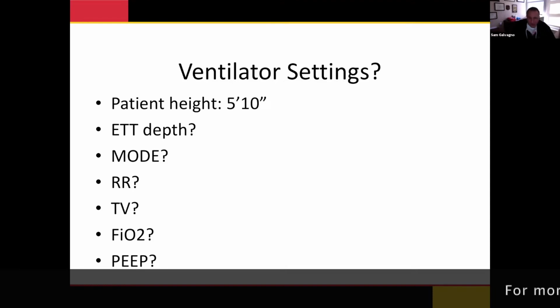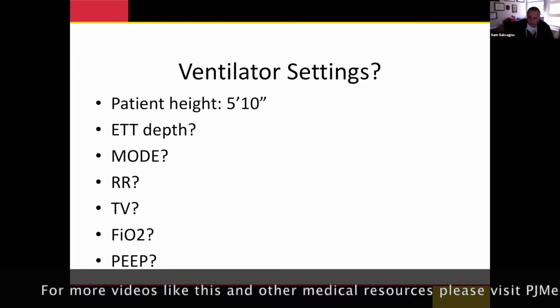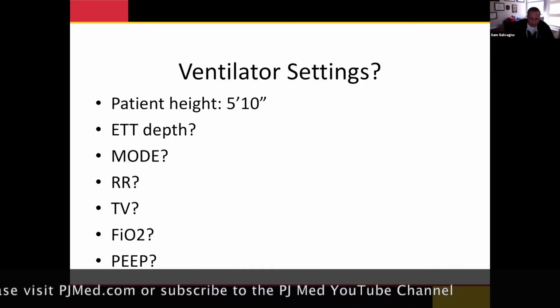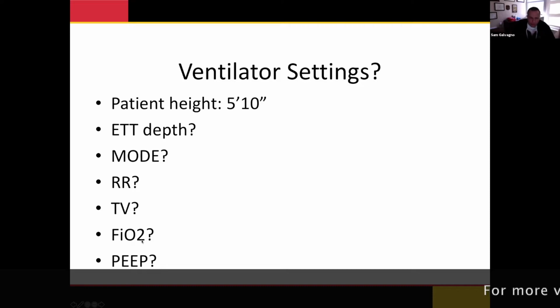Yeah, exactly. An obese patient has a lot of chest wall compliance elastance that they have to overcome, and so maybe a higher PEEP to start if their blood pressure is looking good. Don't disagree with that at all. I think what we're seeing with these COVID patients, though, is just to be careful with the PEEP. Like we said before, they may start with a relatively high FiO2, but that doesn't mean we want to jump right to our ARDSNet tables.